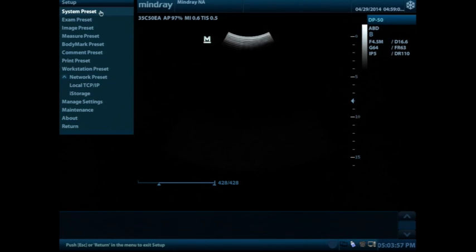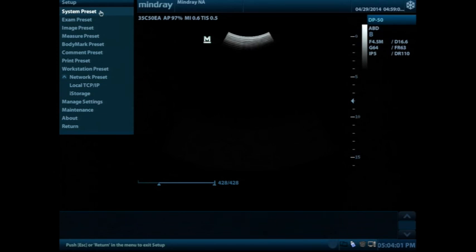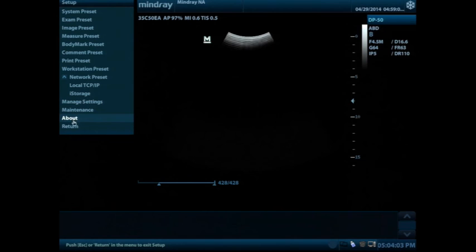When you're done in the setup, you want to go ahead and hit the escape button up here in the top corner or you can scroll down to the bottom of the setup list and press the set button on return.